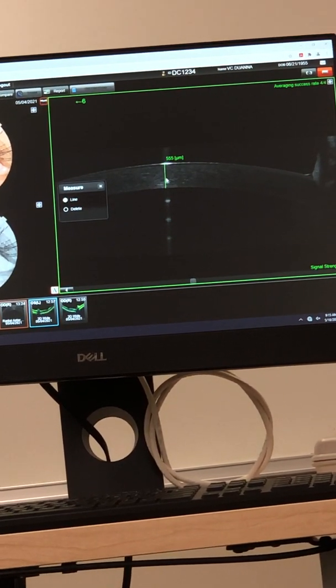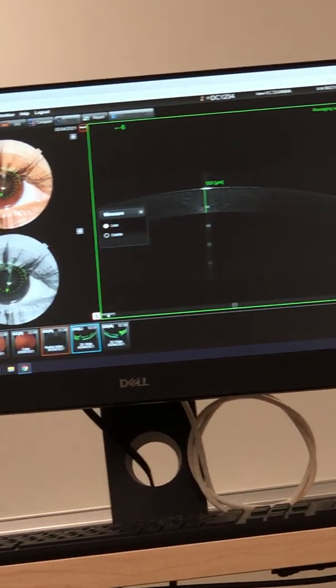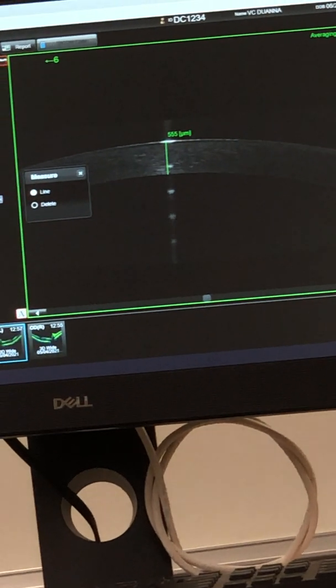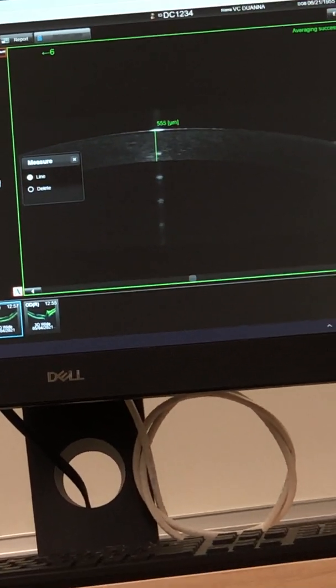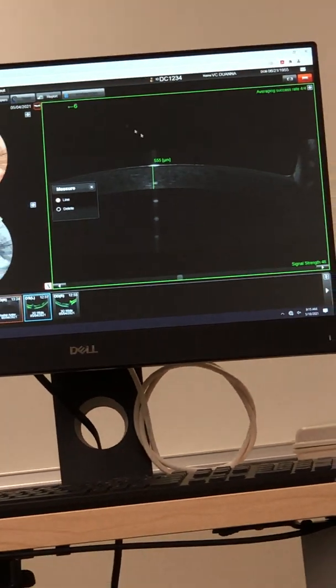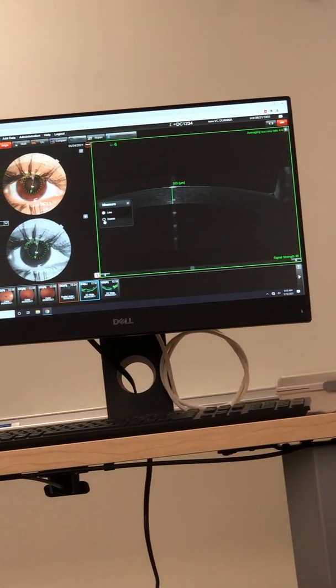Okay. Yeah, so it'll give an optical artifact at the apex of the cornea, so to speak. Gotcha. Cool. And that's 555, clearly. Cool. Average trend. And then you can delete it too if you wanna.